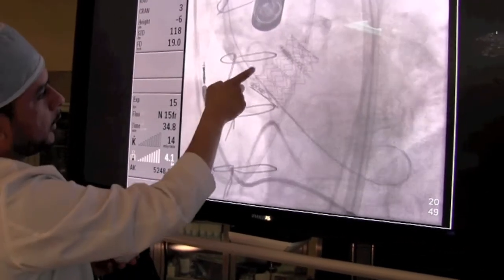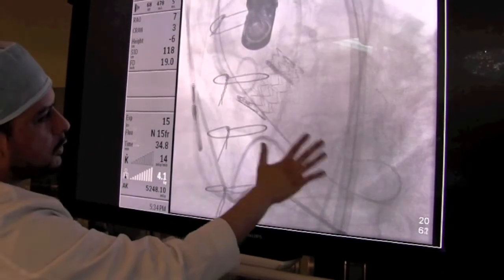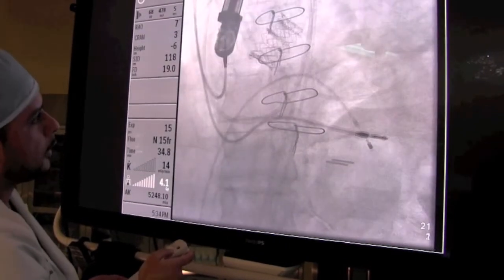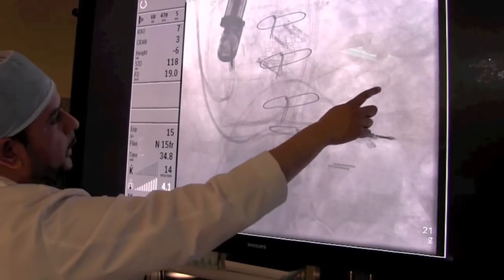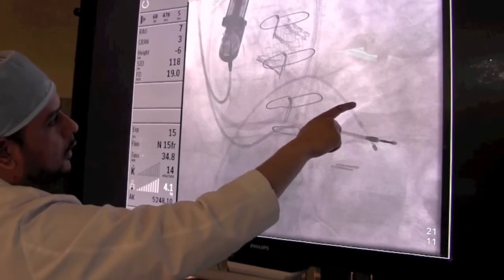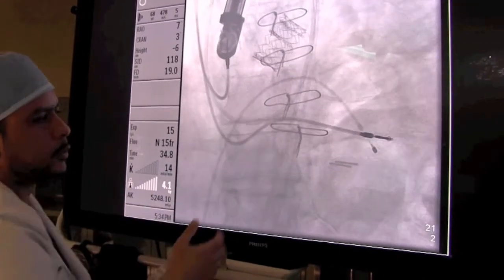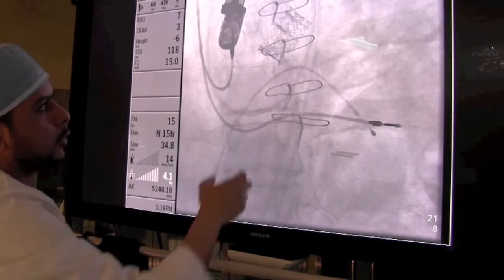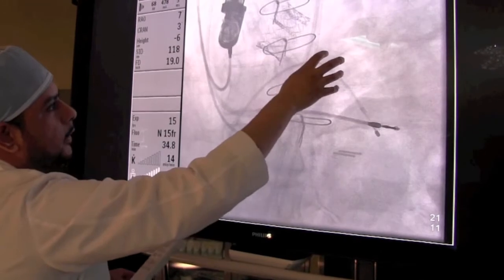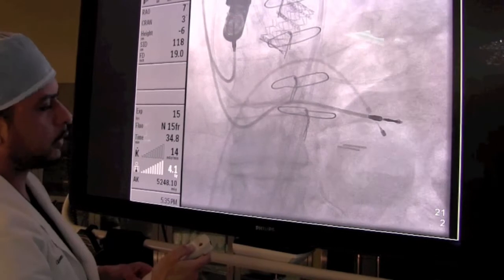Then we check by doing an aortogram — we bring the pigtail catheter back down and inject some dye to show that there's no leakage across this valve, which is very important. We then put another pigtail catheter across the valve and take that wire out, and we measure the pressure difference across the valve. As you saw, there was no pressure gradient at the end, which means his aortic stenosis is cured — there's no more difference in pressure between the ventricle and the aorta, which is what you see when you have a blockage due to aortic stenosis.